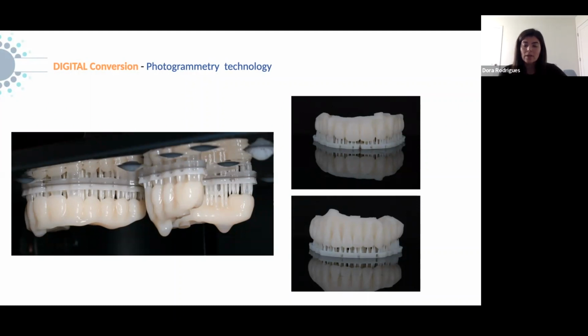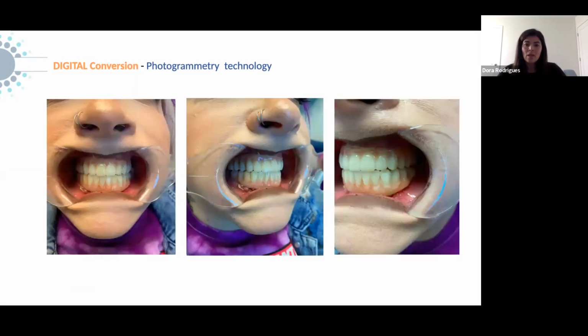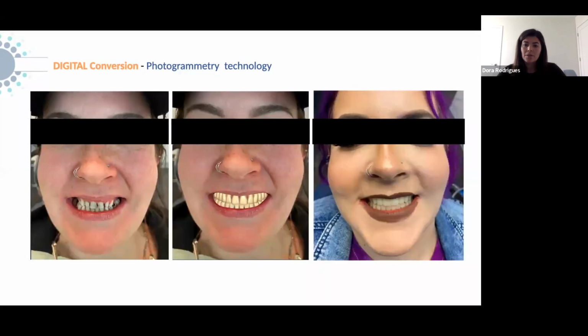It's really, really quick. And once it's clean and cured, I add some paint around. It can be composite. It can be coloring. There's a few different materials that you can use depending on the type of design that you do. And then we just went back to the doctor's office and it was inserted in the mouth. And that's how it turned out.